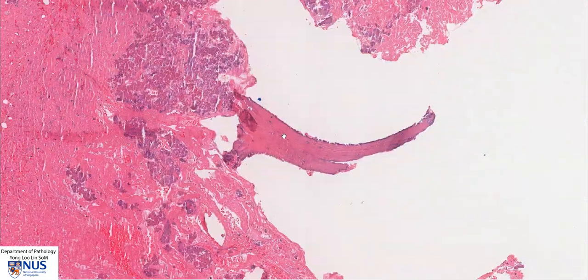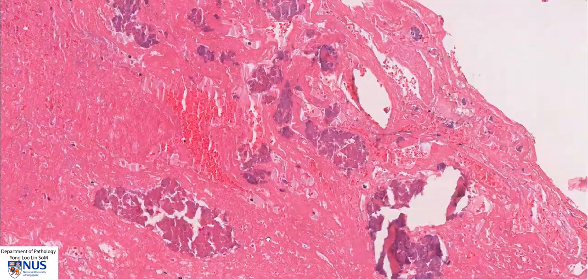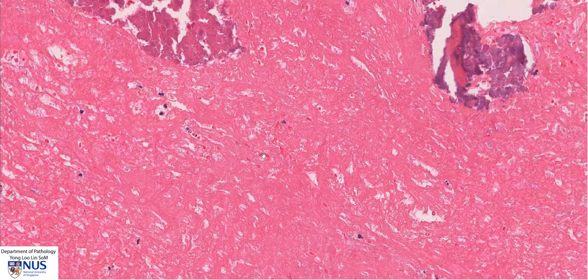Here we can see the bony trabeculae. These are fragmented, and in between we can see lots of fibrin. This pink material is fibrin.